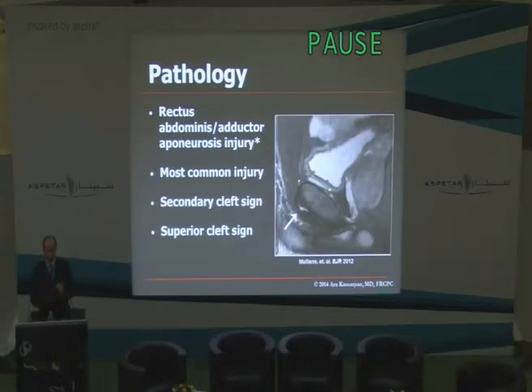One thing I want to stress, though, is it's always important to look at those sagittal images, as was also mentioned regarding MRI techniques, because occasionally you will only find these small tears on the sagittal images. I think if you have good axial and coronal images, you can usually pick them up, as well as some of those oblique coronal images that are often used. But I always like to review the sagittal images as well.